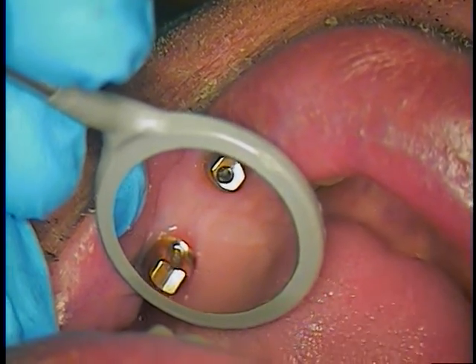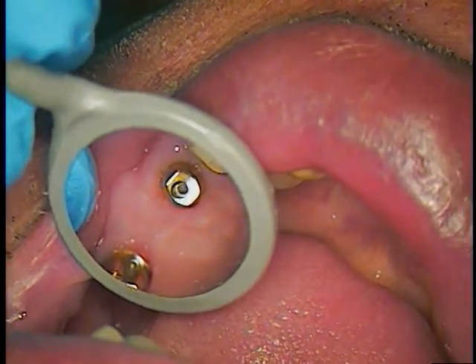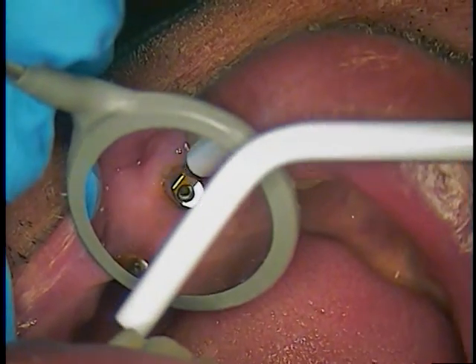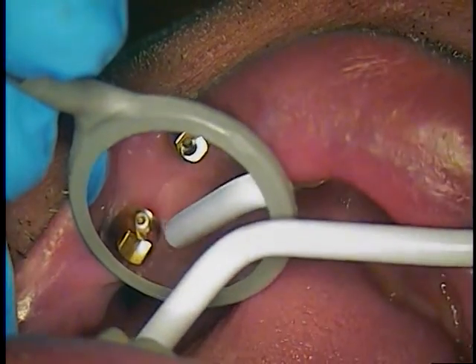Good morning, hello and welcome back. This is Dr. Jerry Cuomo. I'm here with my patient and he is just back from Europe. Had a good time and now we're ready to try into this bridge. Right now what we're dealing with are ankylosed abutments.